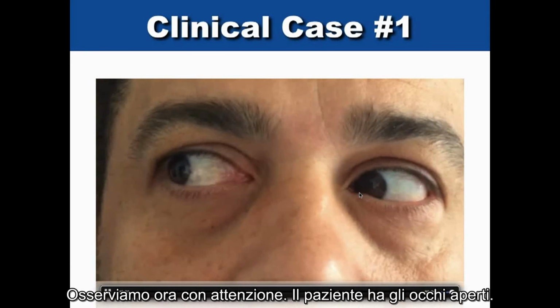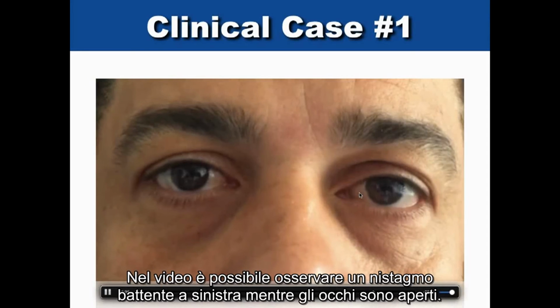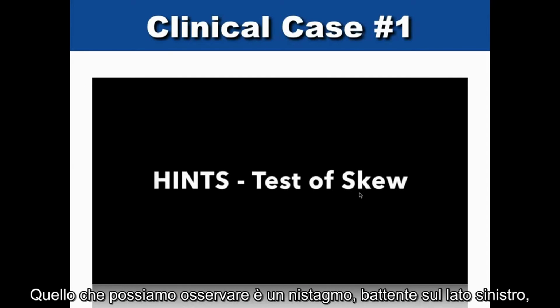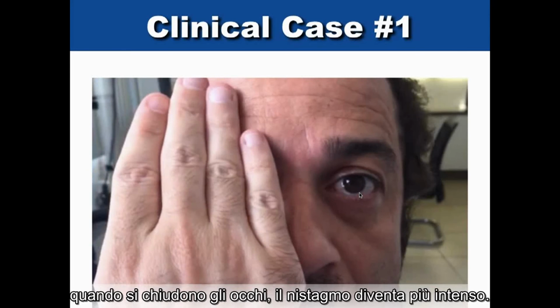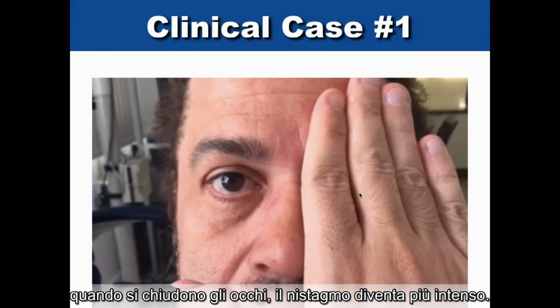So let's pay attention here. The patient has eyes open. With the video, you see a left-beating nystagmus with the eyes open. You can see the nystagmus beating to the left side. When you close the eyes, the nystagmus becomes more intense.